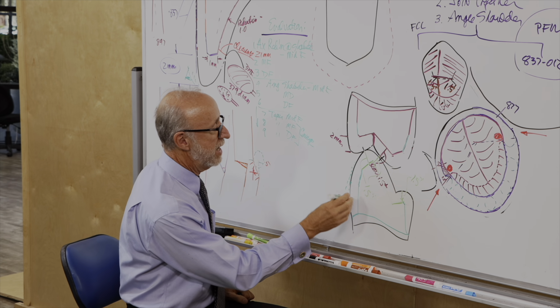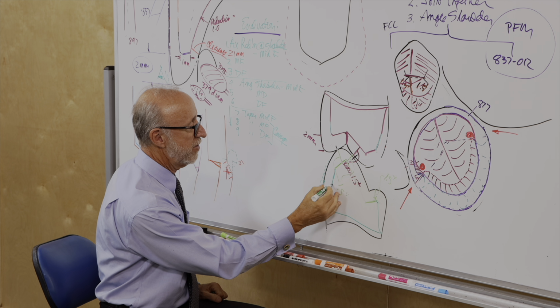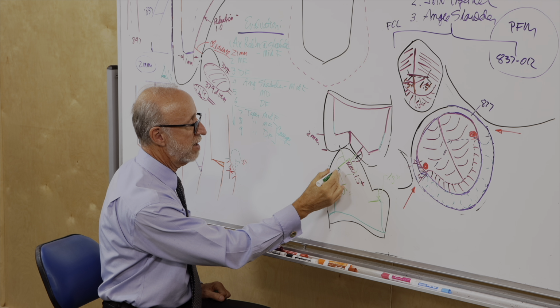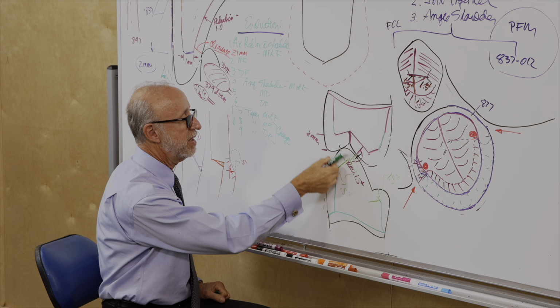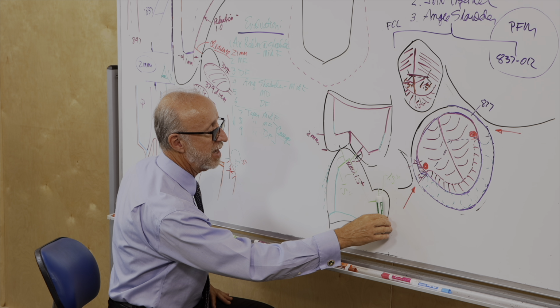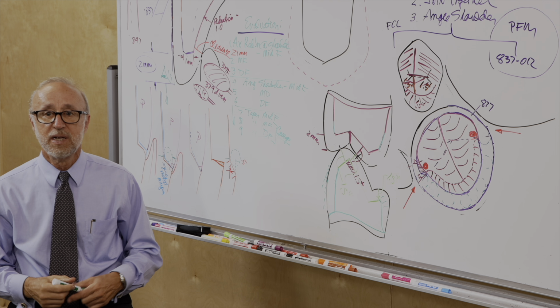So again, we take the taper on the facial from the middle third. So that's the 2/3. We take the taper for the secondary plane from the occlusal third. That's the third here. So that's what we do. Then the A plane is going to be like this. So that's the facial reduction with the secondary plane. On the lingual, obviously we do some taper like that. And we have plenty of gold here, so we don't need to have a secondary plane there.